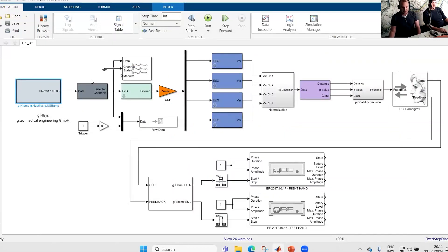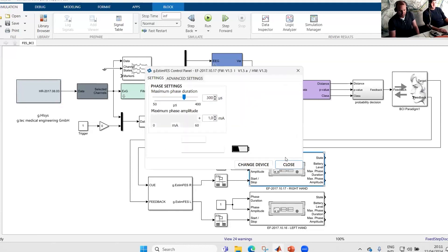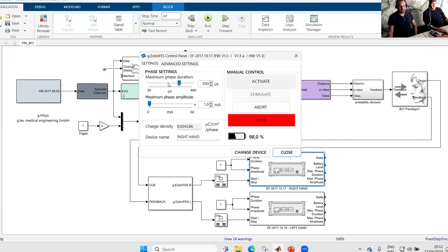What we have to do then is to check the stimulation of the right and left hand. I'll start with the right hand — I double-click the stimulator. Whenever you double-click it, the stimulator does a self-test. If everything works fine, the control panel is available. We can change main settings like the phase duration and the phase amplitude. Typically for this movement, we use a phase duration of 300 microseconds and the phase amplitude, which we modify to see how much current we need for a proper movement.